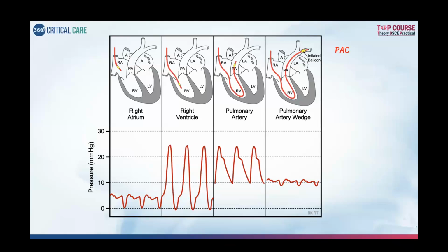Similarly, why do you put in an art line? The art line will not improve the outcome, but the information that you get from an art line, you use it to treat someone, similar to the PA catheter. So you need to know about the evidence around it. Okay.